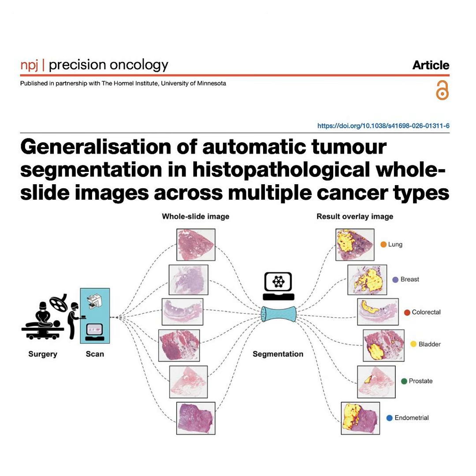And then they pitted those specialists against this new pan-cancer generalist model. The generalists performed just as well, and in some metrics, actually better than the specialists. Oh, wow. So because the combined data pool was so massive and varied, it basically forced the AI to look past the organ-specific architecture. Yes. And it had to find the underlying visual signatures of cancer itself, like cellular chaos, or the breakdown of cell walls, or those nuclear aberrations that are just common to all tumors.